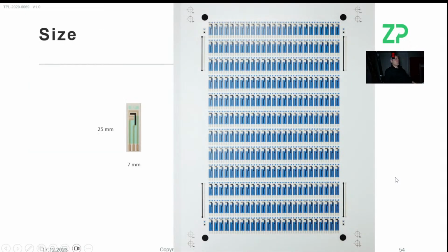Just out of interest, one of my concerns with the product that's being asked for here is possibly its size. It sounds like it's getting quite big. And when I say manufacturing density, in this sheet, for example, we're able to make 300 electrodes at a time, so our manufacturing throughput's quite high. Once you start making a much larger object, the number of electrode arrays per sheet decreases, and you're going to be paying for that, because the more we can make per second, the lower the overall cost per electrode array is.